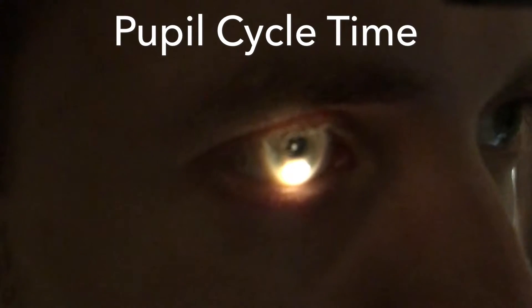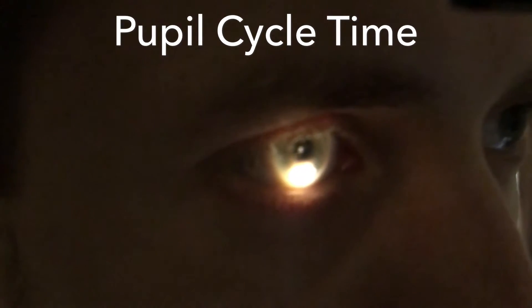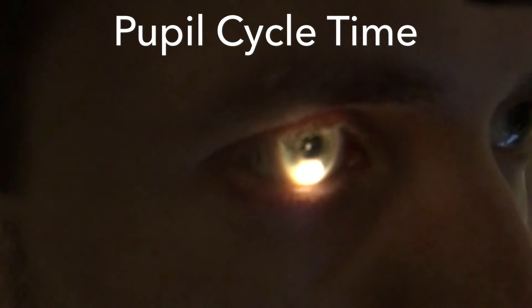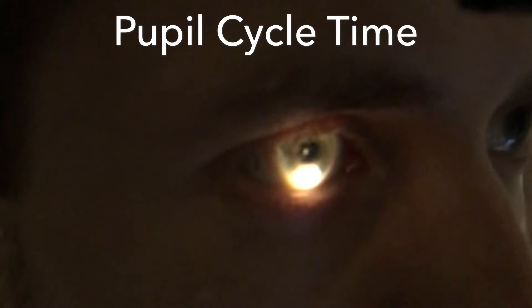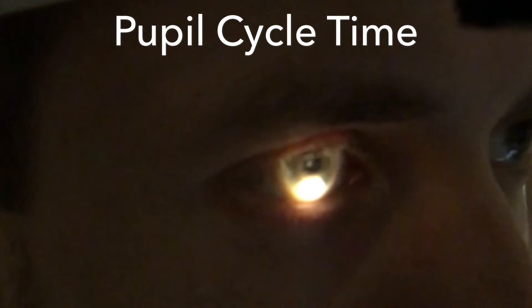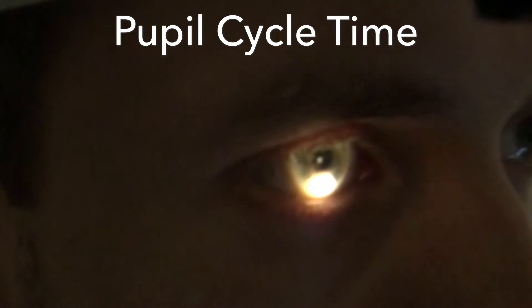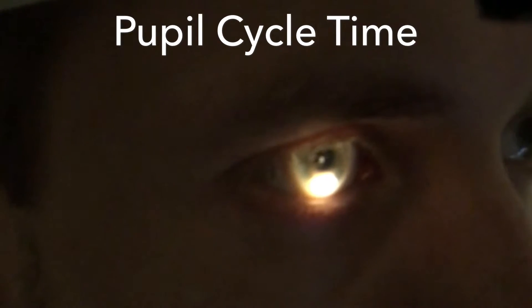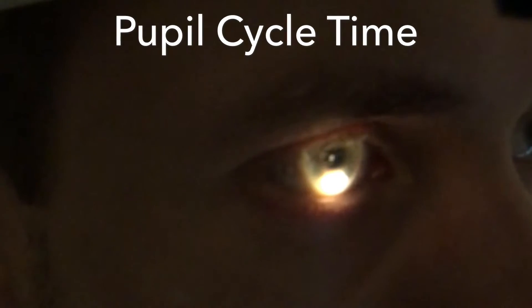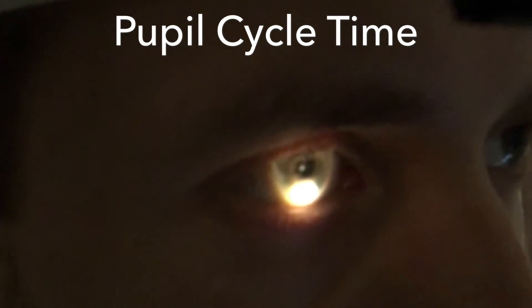Once it's happened a hundred times, we'll convert the seconds to milliseconds and calculate pupil cycle time, which is the equivalent average time in milliseconds for a single cycle of constriction and dilation to occur. Normal pupil cycle time is about nine hundred and fifty four milliseconds or better.